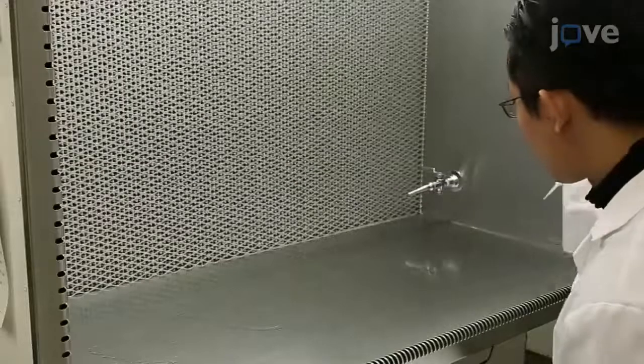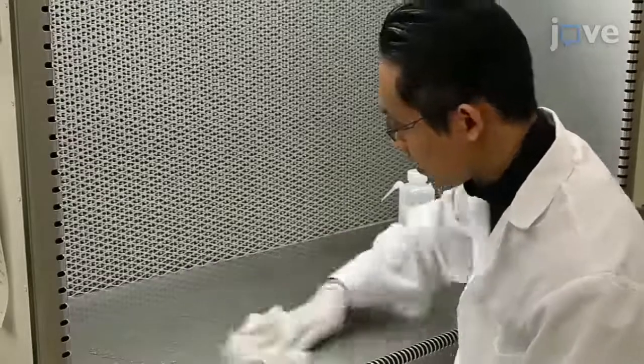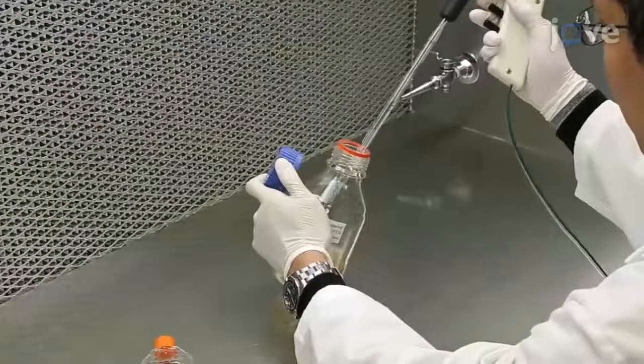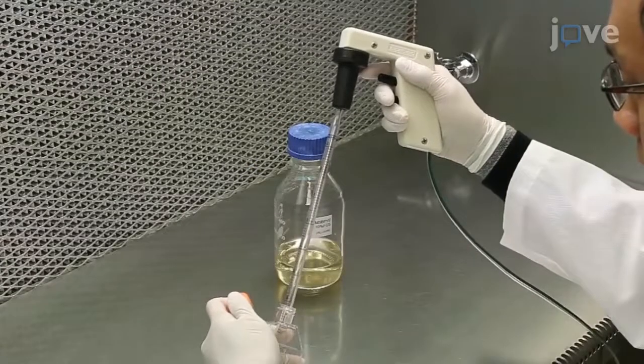After wiping down the work surface of a laminar flow hood with 70% ethanol, dispense 5 mL of the appropriate medium into a 25 cm² T25 flask.